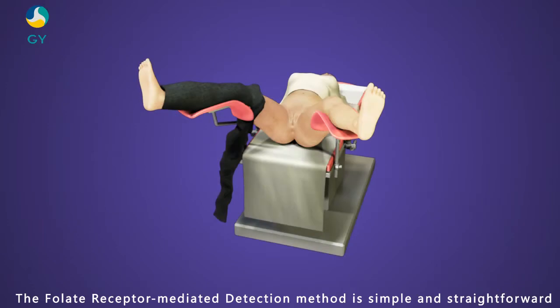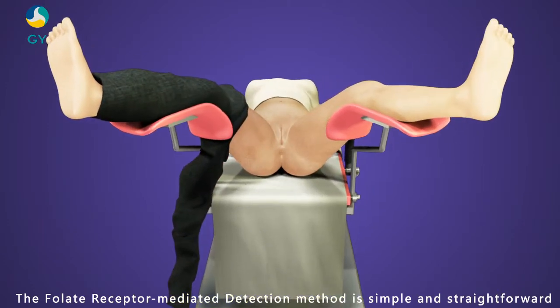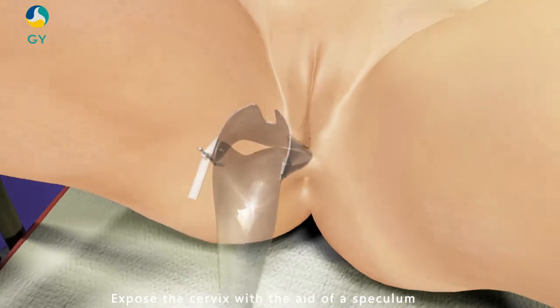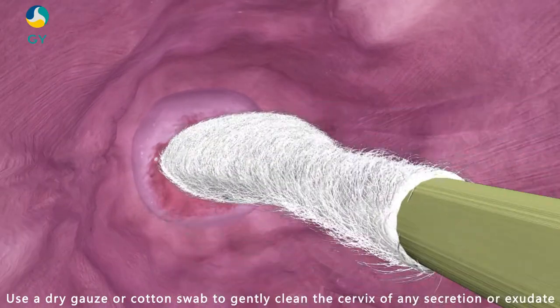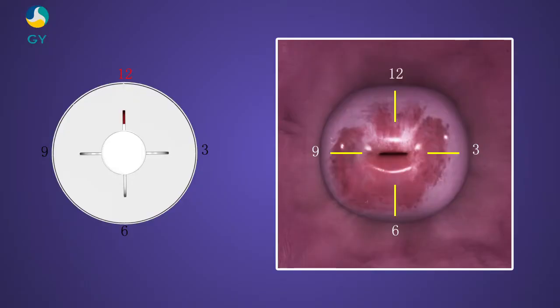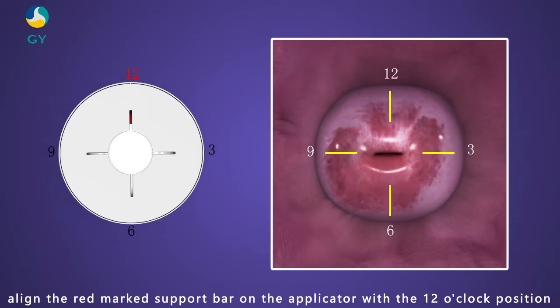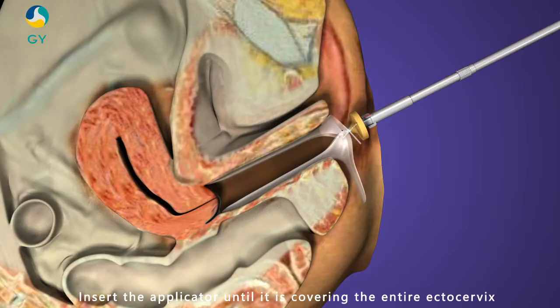The folate receptor-mediated detection method is simple and straightforward. Start by placing the patient in a lithotomy position. Expose the cervix with the aid of a speculum. Use a dry gauze or cotton swab to gently clean the cervix of any secretion or exudate. Align the red mark support bar on the applicator with the 12 o'clock position of the ectocervix. Insert the applicator until it is covering the entire ectocervix.